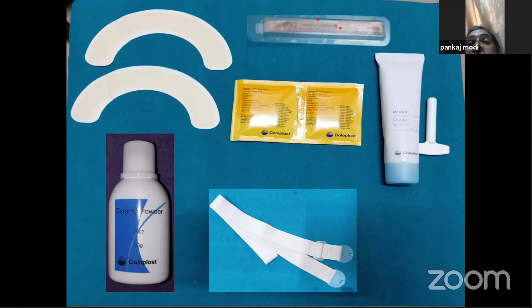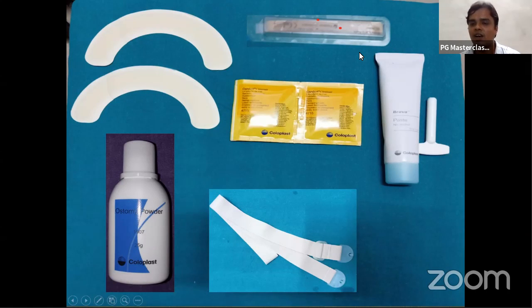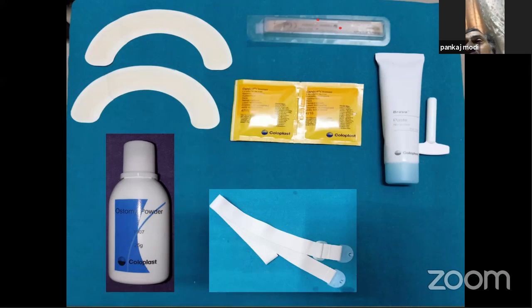If it is, can you use Fevikwik? No sir, we can't use it. Why not? Sir, it will damage the skin. So here the sticking should be non-irritant and non-damaging, and it should not be very long-lasting. We don't need that much. So karaya gum is a very good material. All the particular pastes are based on karaya gum.